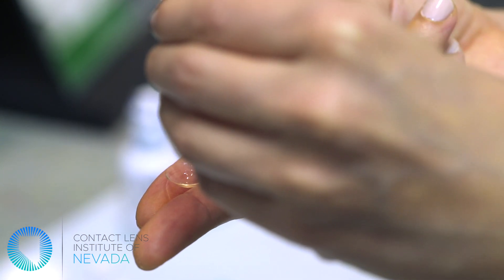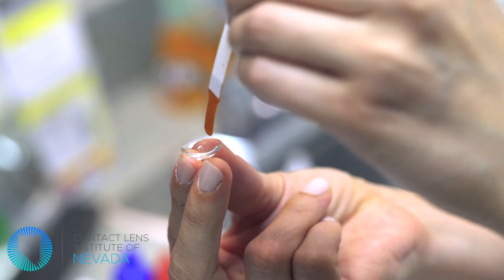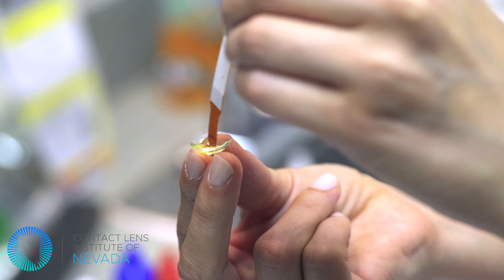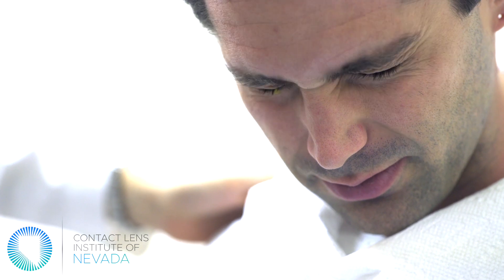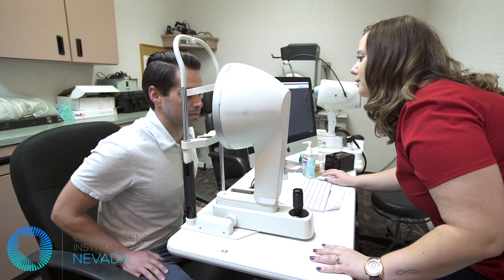The scleral lens fitting process is extremely custom to each patient and may require several visits to your doctor's office. Please be patient with the process, as your doctor must dedicate hours of time to your specialized needs.